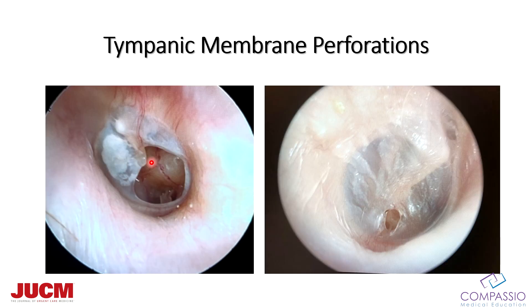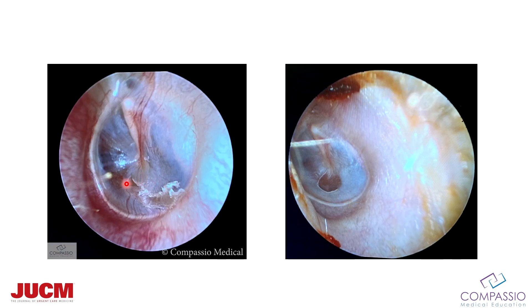Tympanic membrane perforations — here's a left ear with almost a 40% TM perforation in that posterior inferior quadrant. Pretty obvious. This was a little more subtle — a traumatic TM perforation. I would refer these patients to the ENT provider just to get their hearing checked. Here's another traumatic TM perforation that's going to heal no problem. And this one duped me — I thought it was a hole, but it's actually a really thin layer of tympanic membrane.